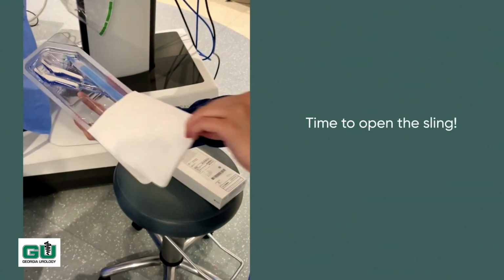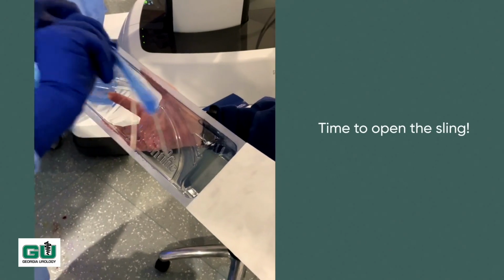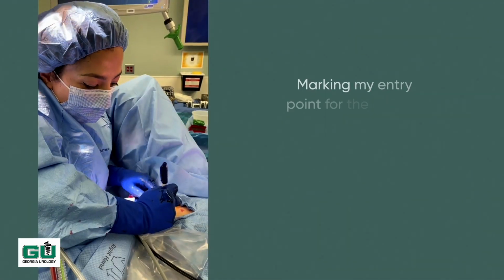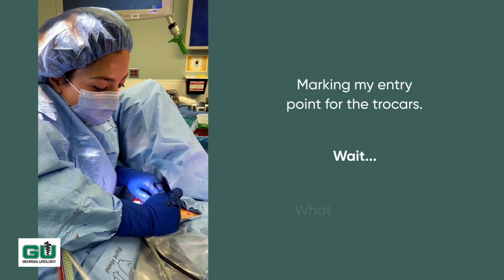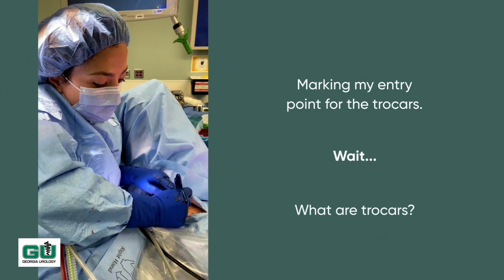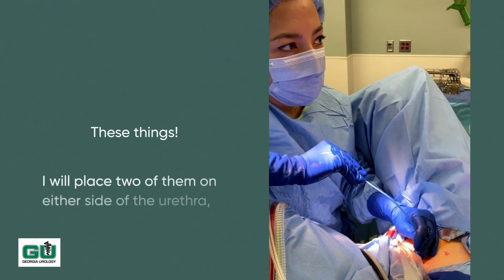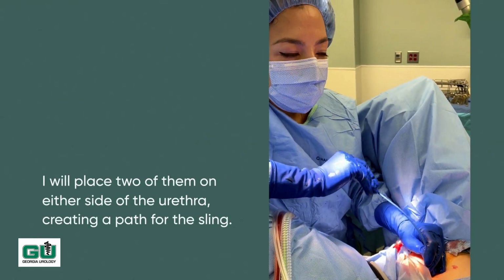Next, we open the sling, which is a long piece of mesh. It's blue in color, and you can see there are these 2 knitting needles that I have to use during surgery. I make puncture wounds just above the patient's pubic bone on either side of midline. So there's 2 puncture wounds here.